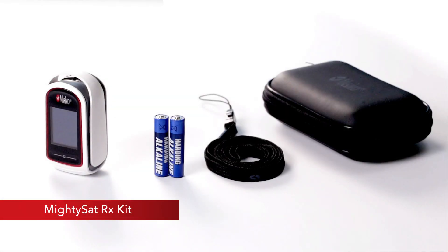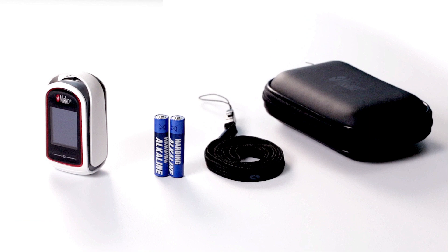The MidiSat RX kit includes one MidiSat RX device, two AAA alkaline batteries, one lanyard, and one carrying case.